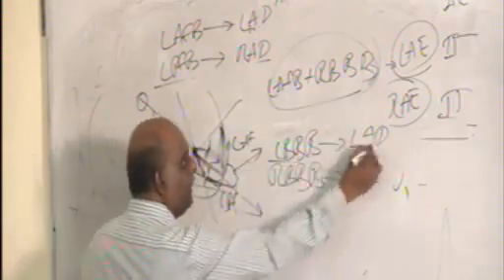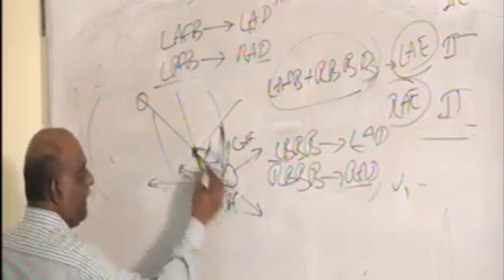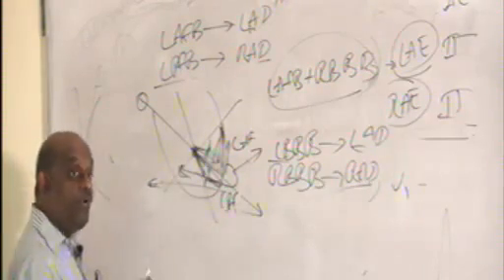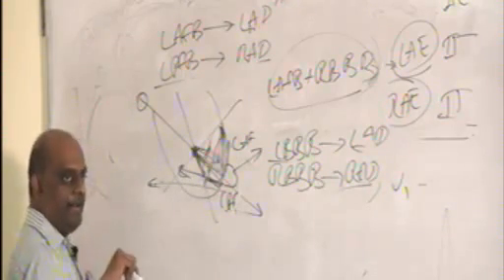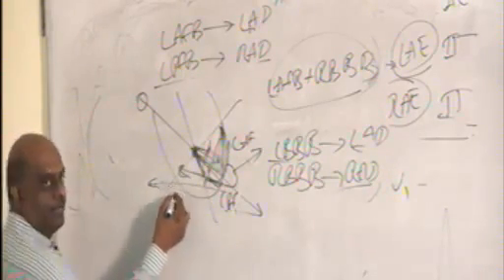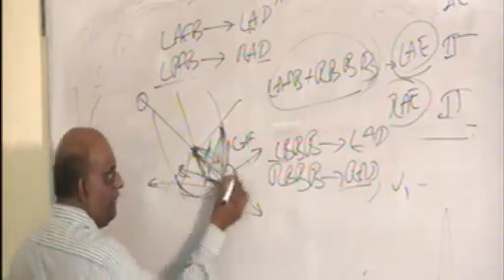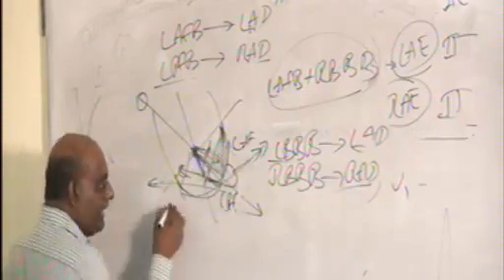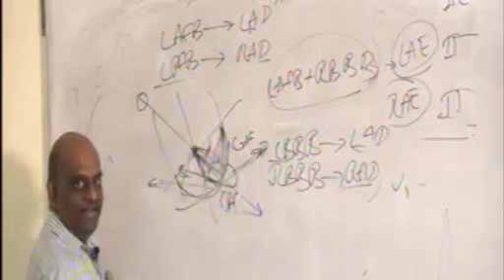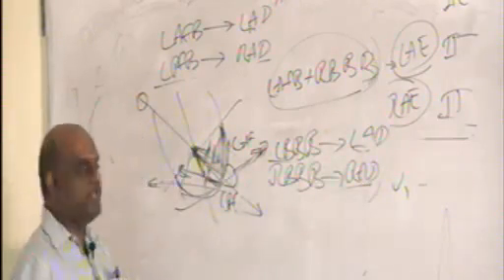Why does left bundle branch block lead to left axis deviation? Now you explain to me. Left bundle got blocked. Then who will supply all the areas supplied earlier by the left bundle? Right bundle. So what will the right bundle do? First it will finish supplying all its right areas. Then it will be directed to supply the left areas. So entire electrical activity is directed towards left. That is the reason left bundle branch block leads to left axis deviation.